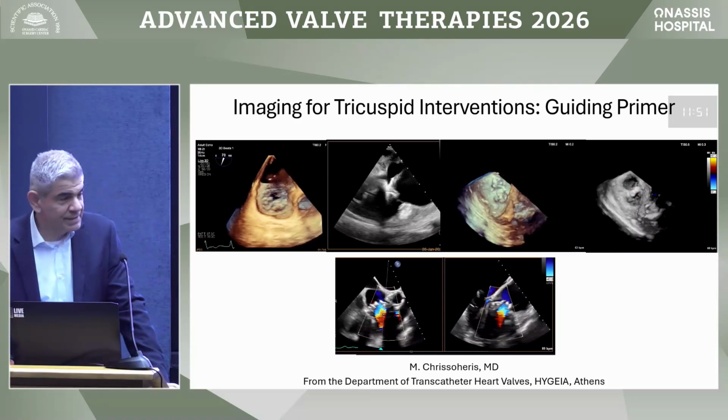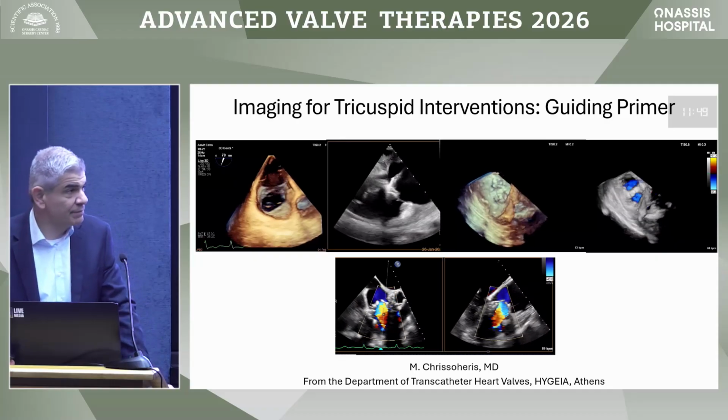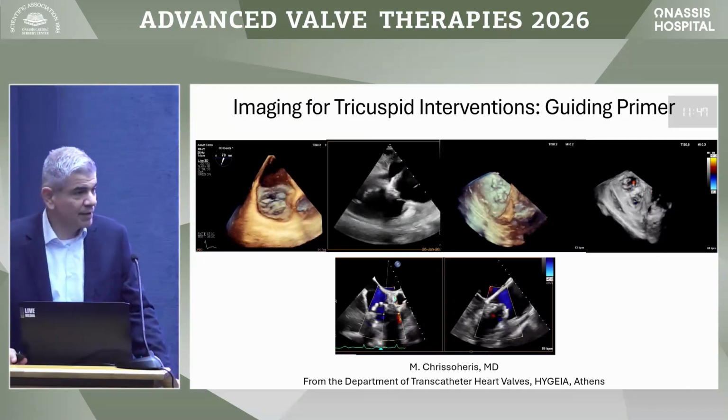On behalf of the heart team at Hygeia Hospital, we'll be discussing imaging for tricuspid interventions, and particularly as a guiding primer.